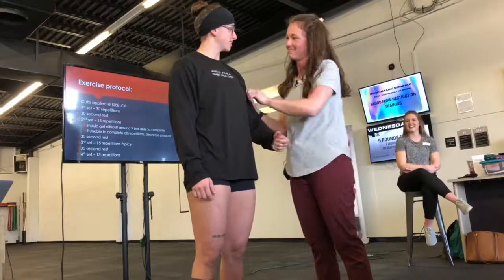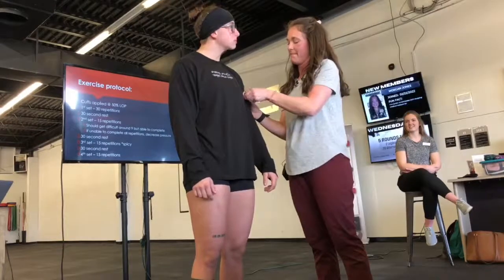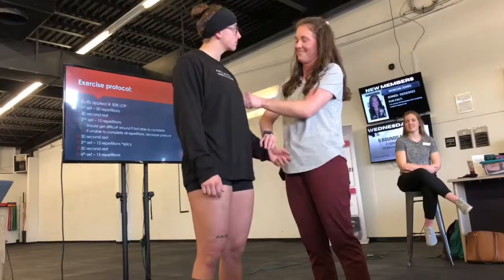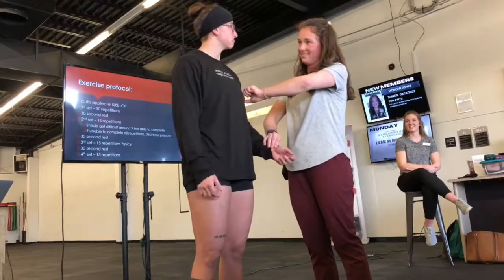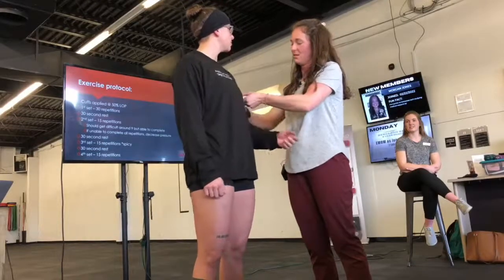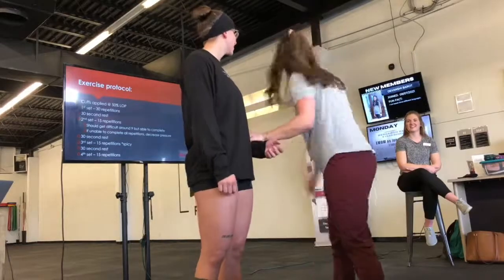Do you feel like it's getting tight? A little bit. Okay. Very tight? No? Not like a blood pressure cuff. Just keep it... Okay. That's pretty tight. Okay, perfect.